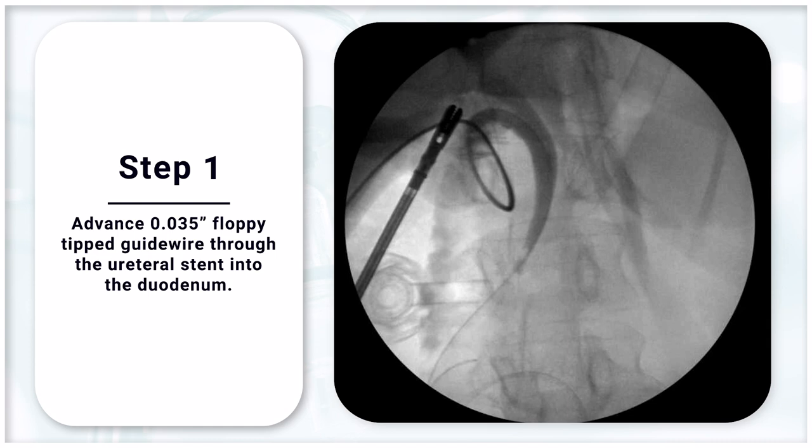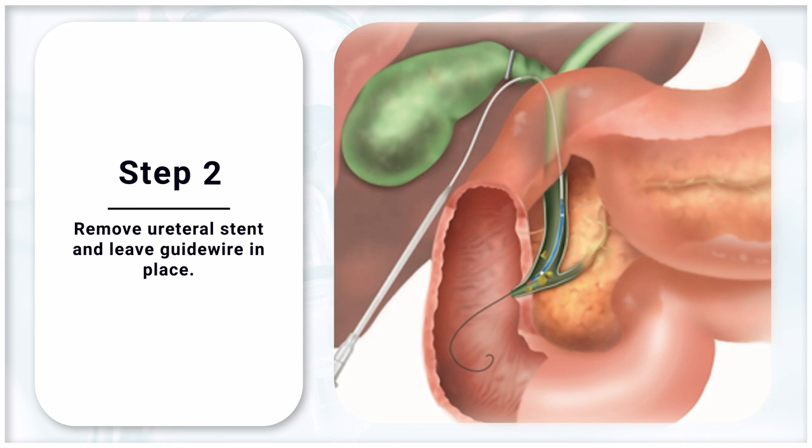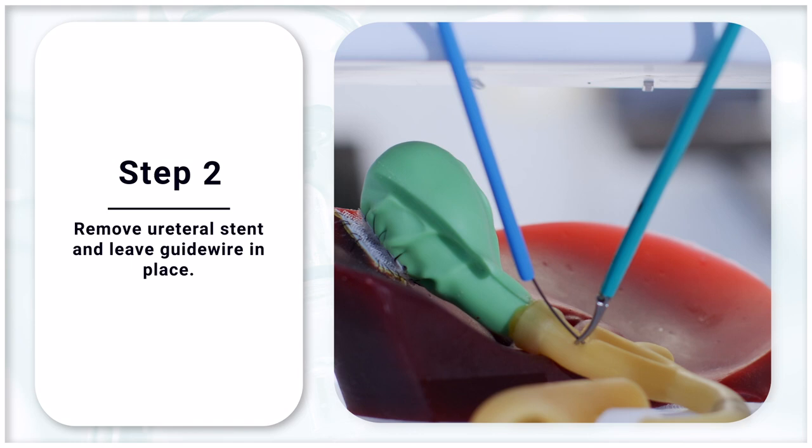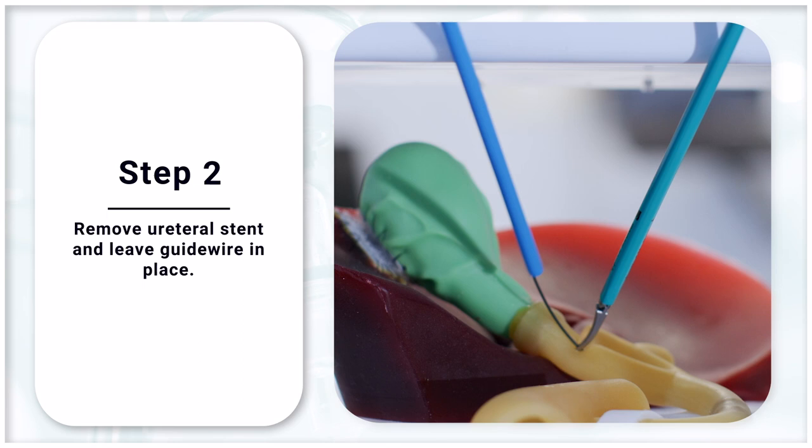Step 2: Remove the stent and leave the glide wire in place. Oftentimes we will grab the wire intra-abdominally at the site of the ductotomy to prevent the wire from springing back and losing access. It should be noted that we do leave the wire in place for the majority of the steps below, with the exception of when we are performing a cholangiogram or power flushing.